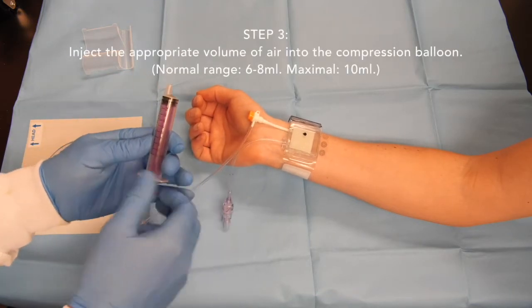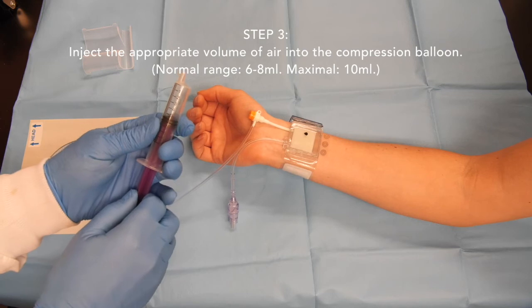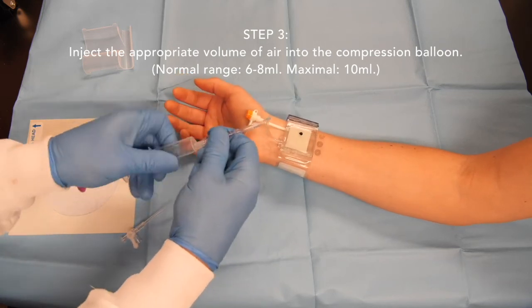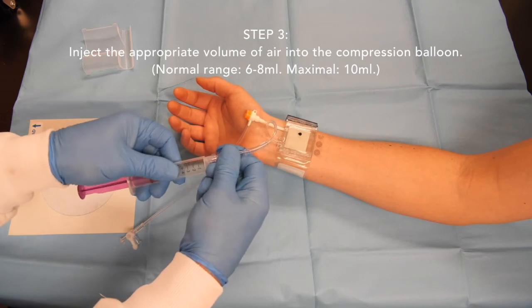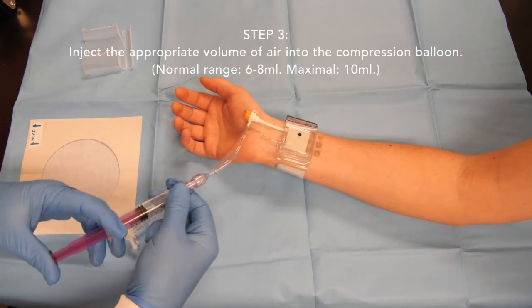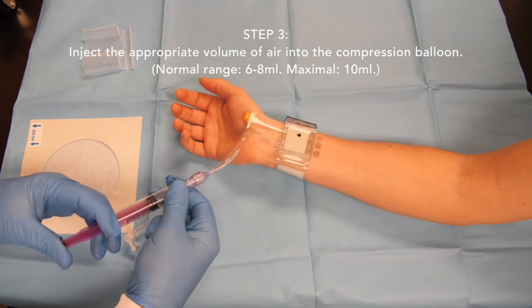Charge the syringe with an appropriate volume of air, typically close to 7 ml. Connect the socket end of the syringe to the plug end of the air valve with a gentle 180-degree clockwise rotation of the syringe.